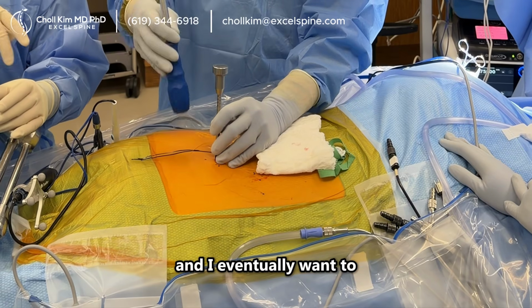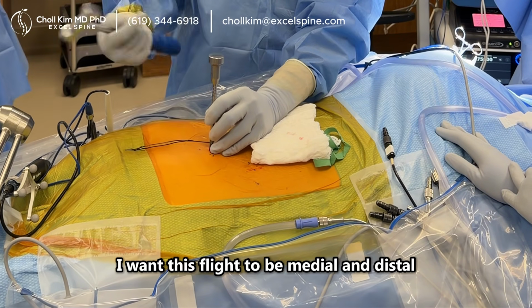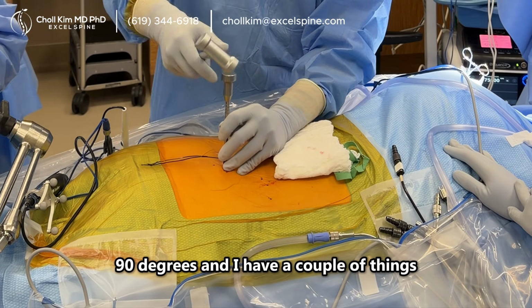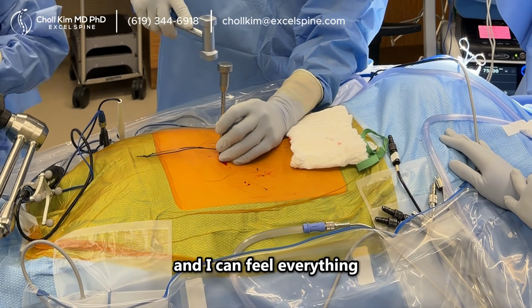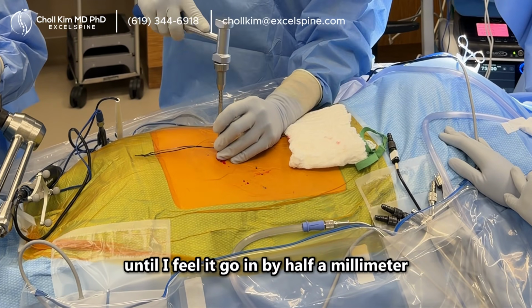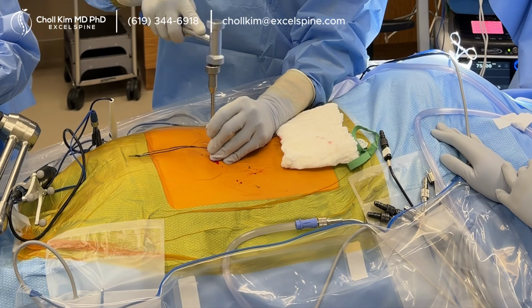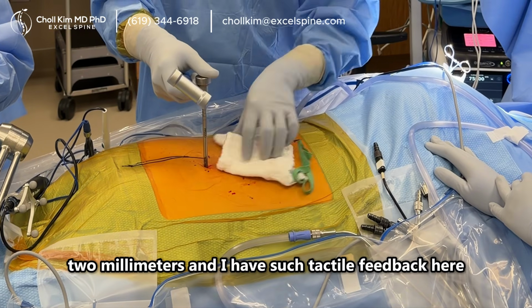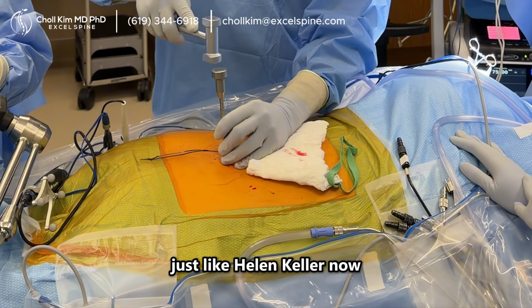And I eventually want to, since I'm doing an L4-5 MIS TLIF, I want this flight to be medial and distal, otherwise it's going to get in my way. You still want to start in the bone 90 degrees, and I have a couple of things. I have my hand on the patient and 3 delicate Asian fingertips on this, and I can feel everything. And it's a titration, until I feel it go in by 1/2 millimeter. Ooh, he's got good bone. Okay, 2 millimeters. And I have such tactile feedback here. If it slides off, I should be able to feel it, just like Helen Keller.